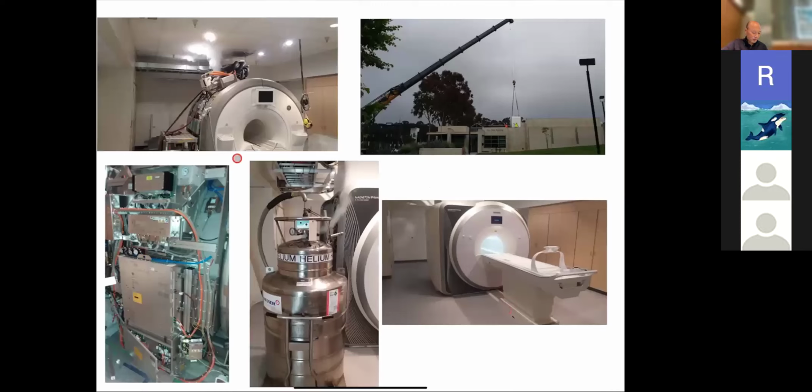So these are some pictures of the magnet at our facility. What you see here is a magnet that's being decommissioned, and we're trying to bring this down to field. We're going from 3 Tesla and ramping it down to 0 Tesla, or turning off the field, so we can move it. What you're seeing here is they're blowing off the helium, that's the helium coming out. And then a crane is used to lift the new magnet into place. It comes partially filled with helium, so we have to add some more helium to it. And then they ramp up the magnet and bring it up to field.